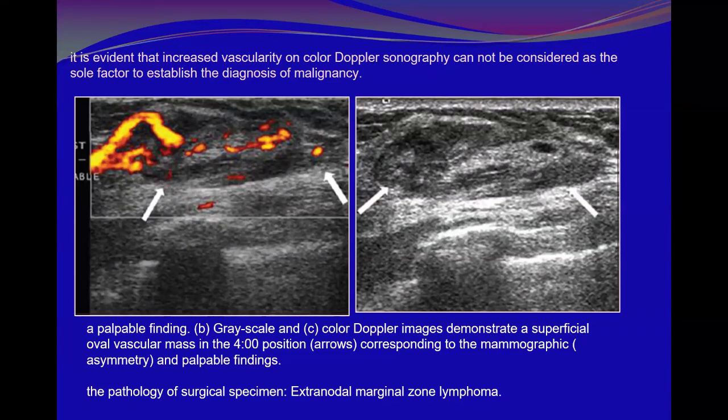A lymph node can be like that, but you see the hamartoma in the breast, it's the breast with an impressive appearance. We can see a mix of hypo- and hyperechogenicity. And sometimes we can see even cystic changes within a hamartoma. It is usually like a fibroadenoma, but it will not be homogeneous like fibroadenoma. Fibroadenoma will be homogeneous, hypoechoic or isoechoic. But fibroadenolipoma, because of the presence of fat along with the glandular tissue, will show a mixture of echogenicity within the same lesion.